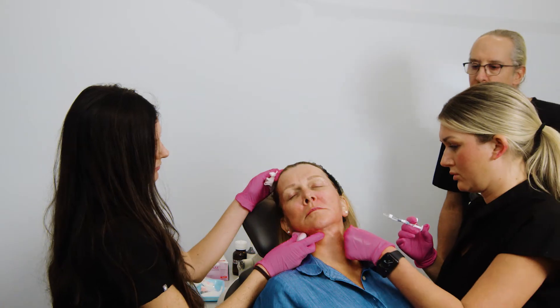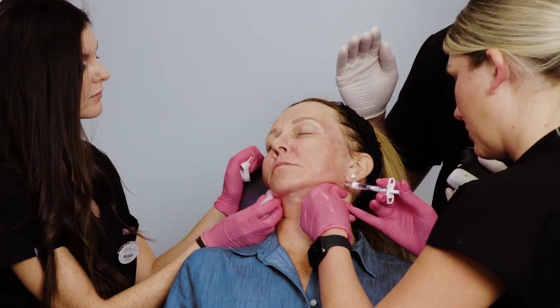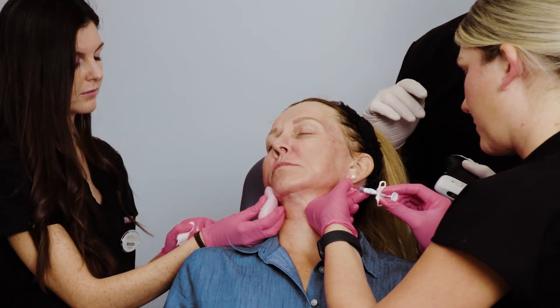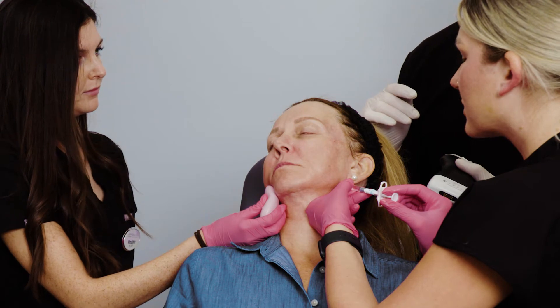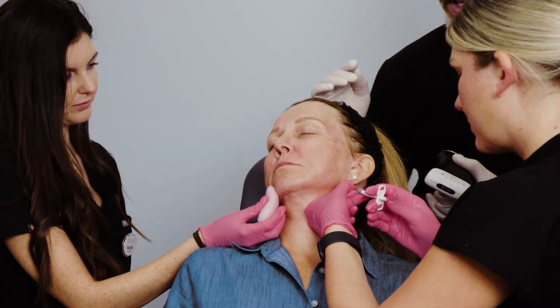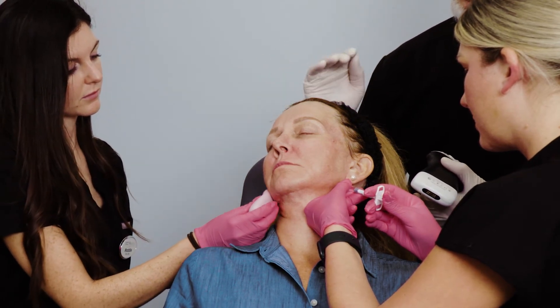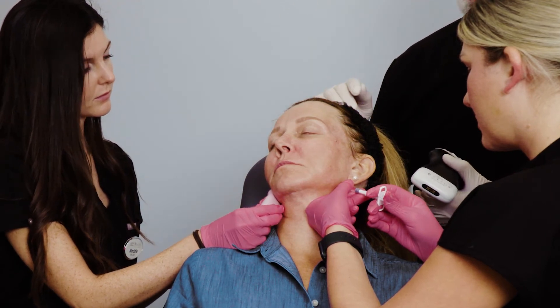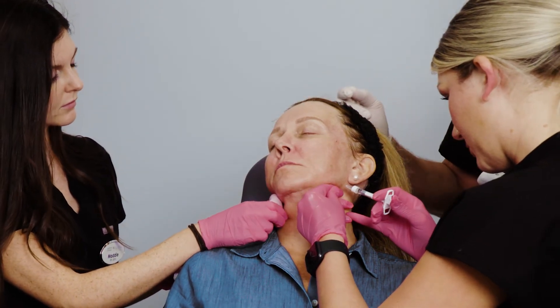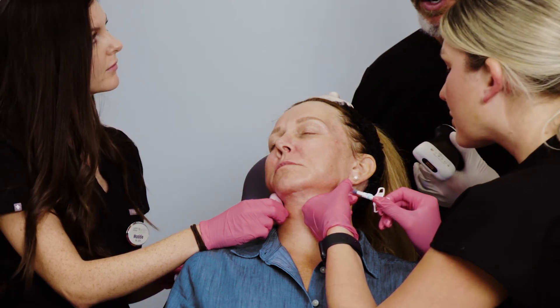What Brittany's going to do is feel the mandibular border, the gonial angle, and the ascending ramus. She's just going to come off the mandibular border about 0.5 to 1 centimeter, aspirate for 10 seconds, and then inject right down onto the mandible. Whether it goes onto the periosteum or in the masseter, what happens is you get reflux along the needle and it does become part of the masseter - but that's okay, it still leads to great improvements in the mandible. She's going to inject 0.25cc, go a little bit anterior and inject another 0.25cc. It's a very safe procedure, particularly when you've checked for the facial artery using ultrasound.